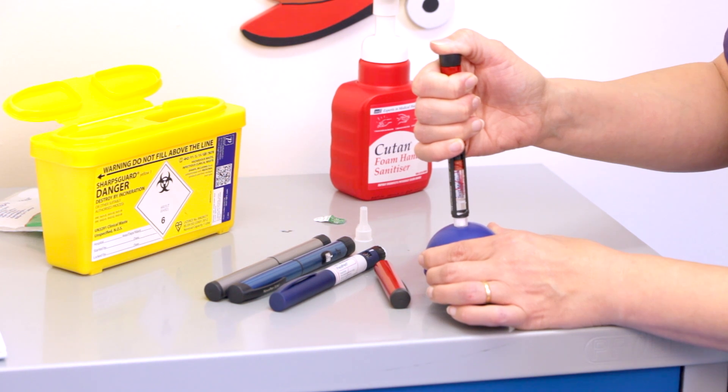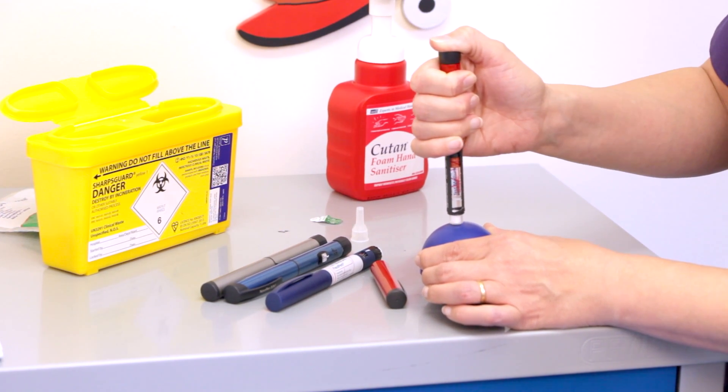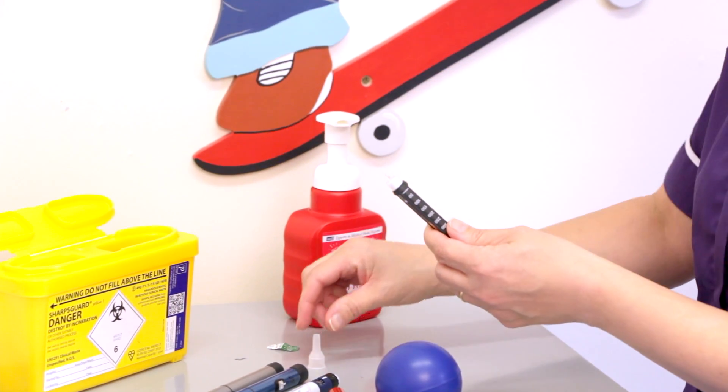Count: one, two, three, four, five, six, seven, eight, nine, ten. Then remove your needle. The next step is safe disposal of that needle.